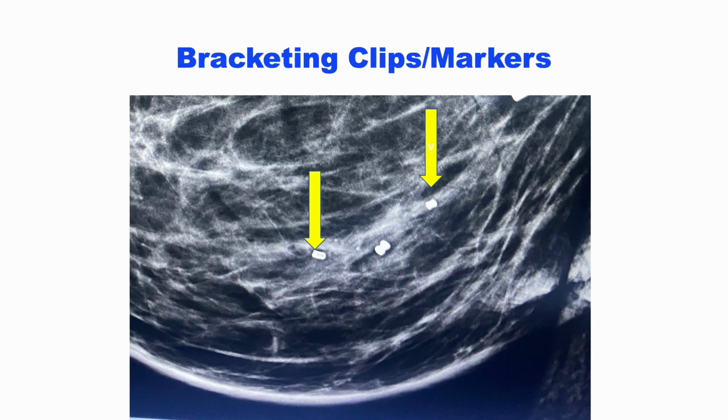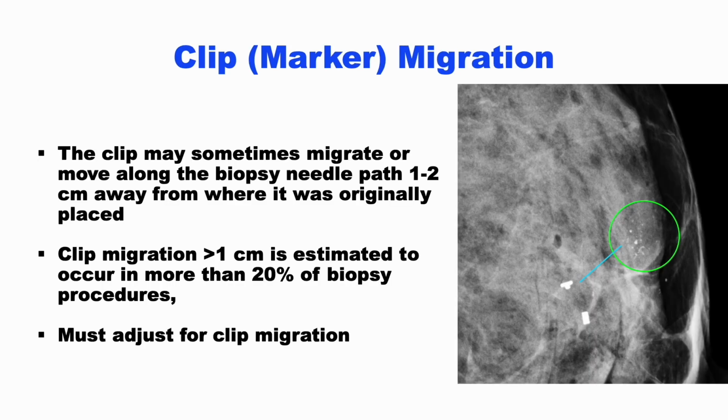Similar to surgery, when the span of the disease, I just made that point. So, in the next slide, I'd like to talk about a problem that is sometimes encountered in breast surgery and breast radiology, and it's called clip migration or marker migration.